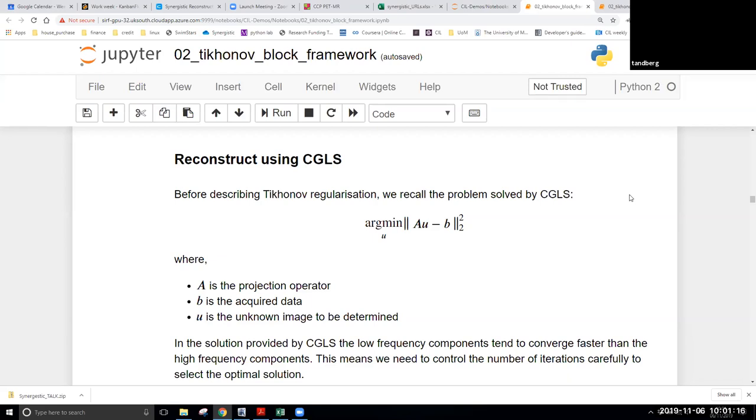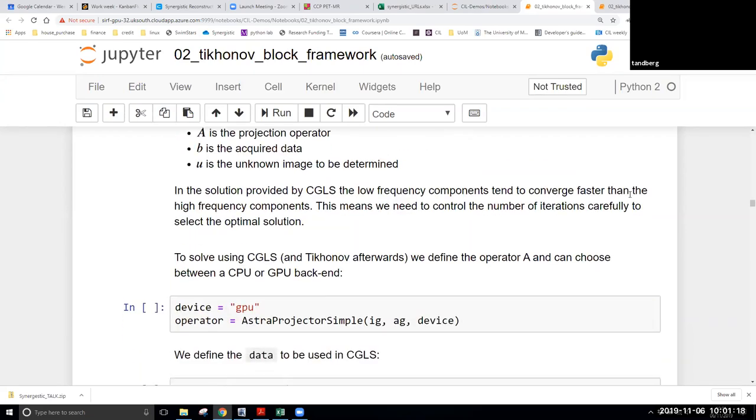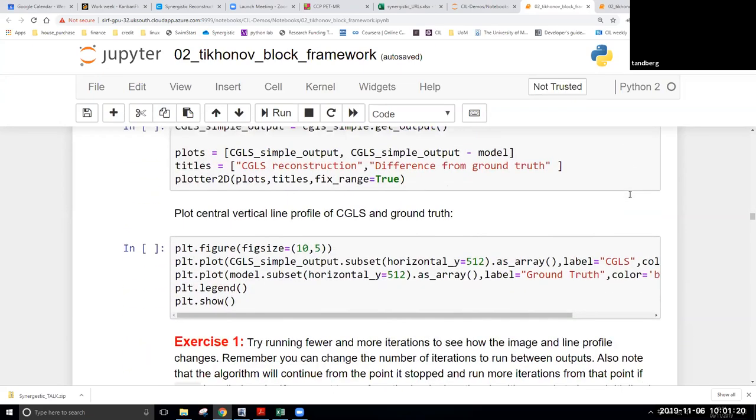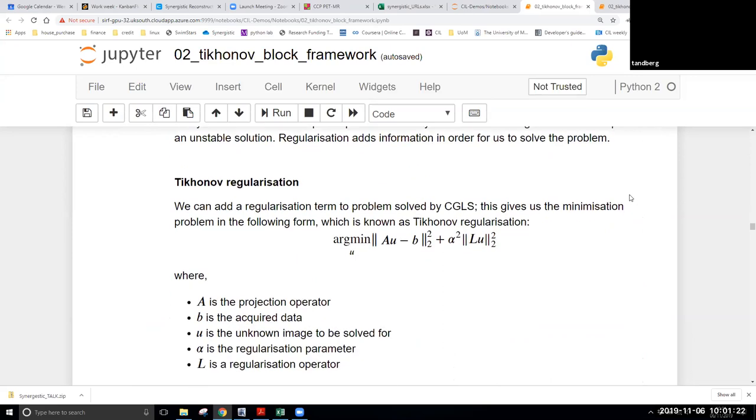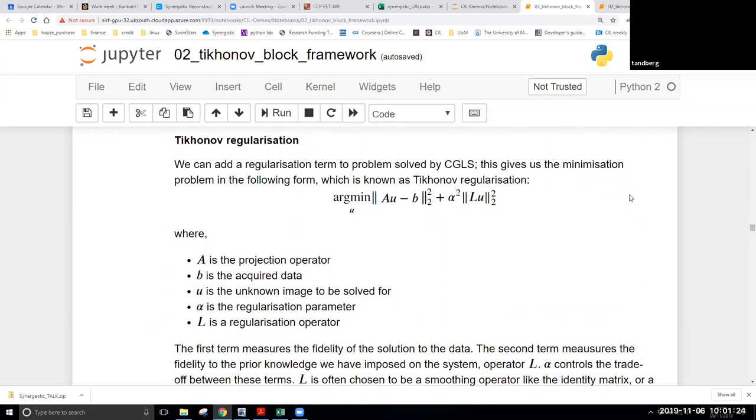Now, with Tikhonov, we're making that a bit more explicit. So, this is the notebook you'll be doing. Instead of just looking at a least squares problem, and many of you will be familiar with this, we'll have this other term, the regularization term, which is adding a penalty on big values in some measure.